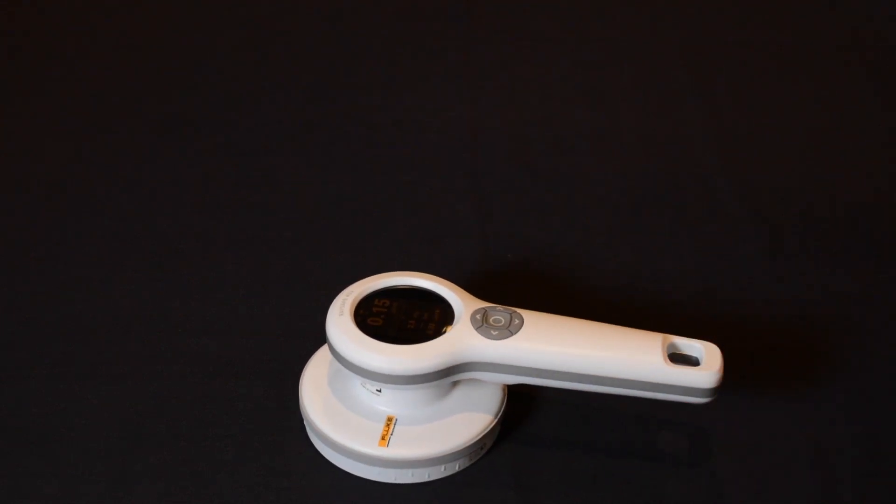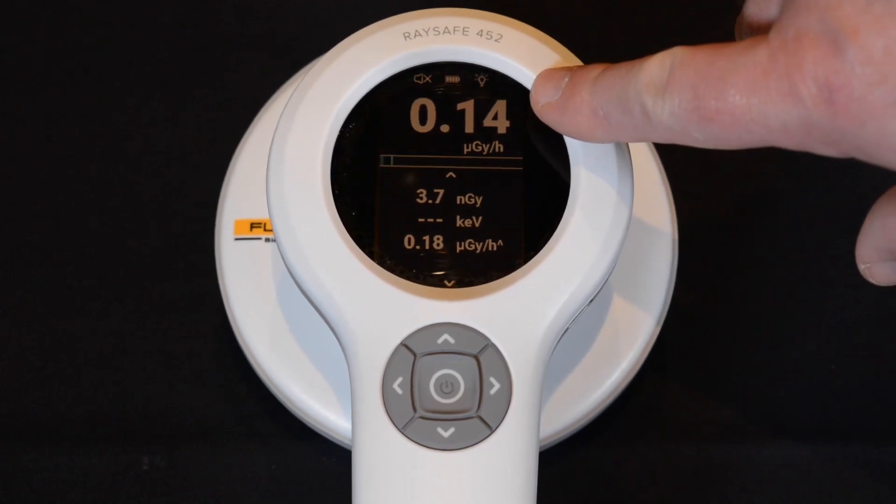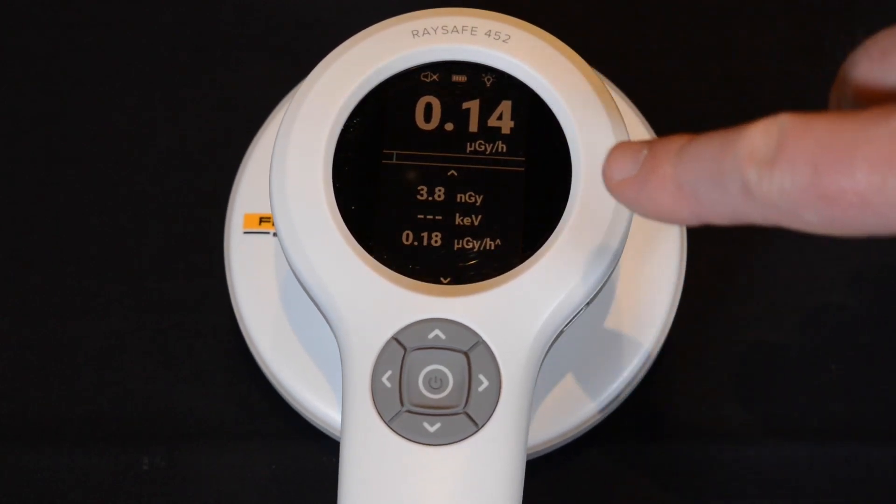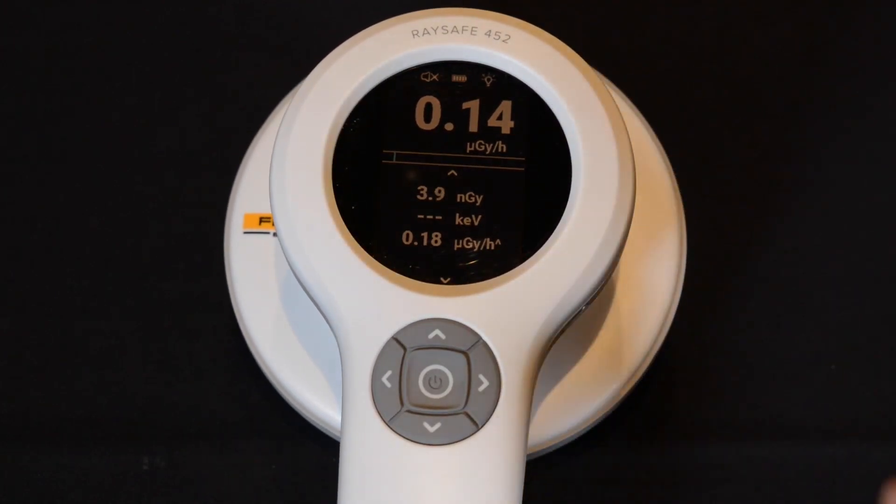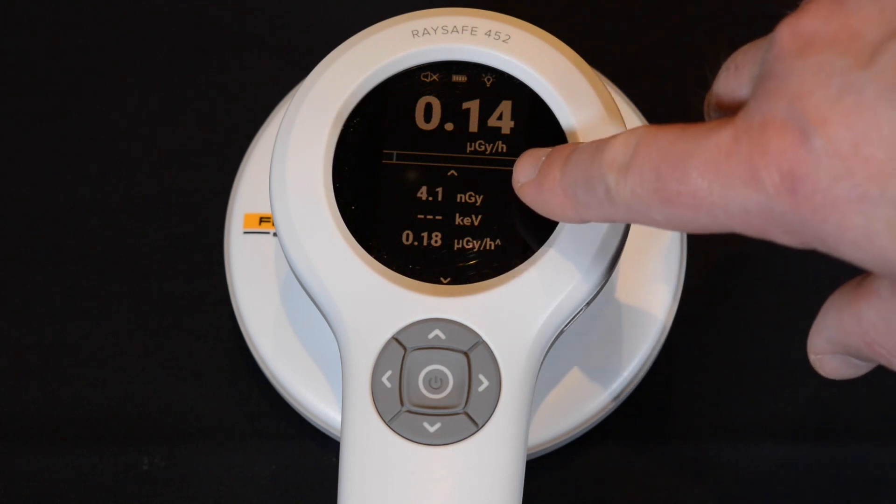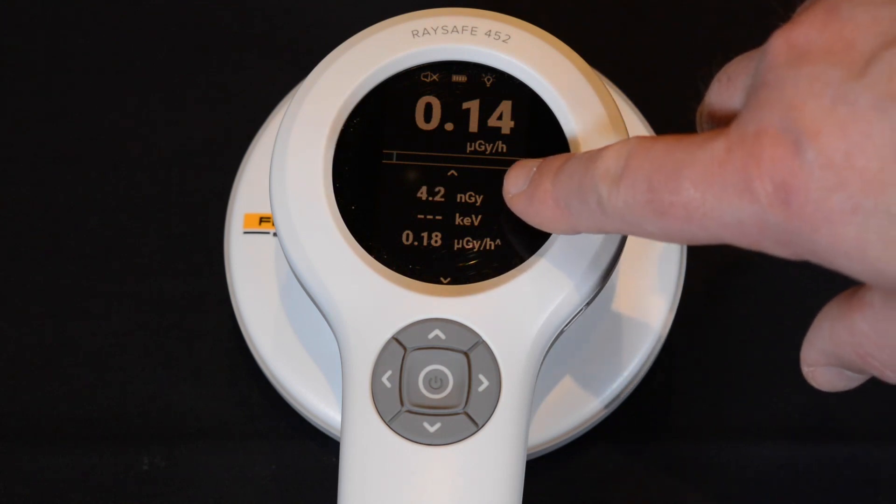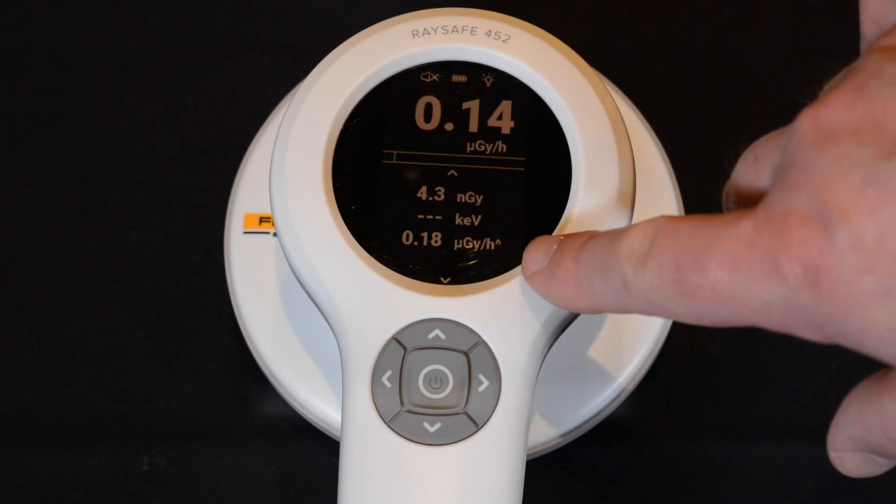The first row always shows the live intensity. Next is the integrated dose for the measurement. If intensity is high enough, you also get the live mean energy. At the bottom, you have the highest intensity recorded.